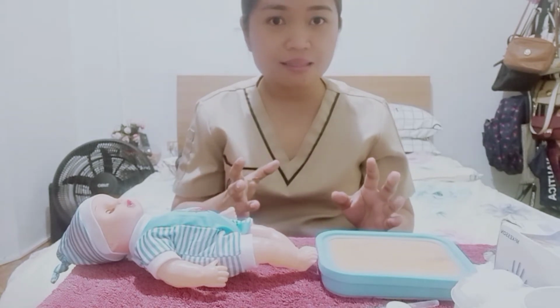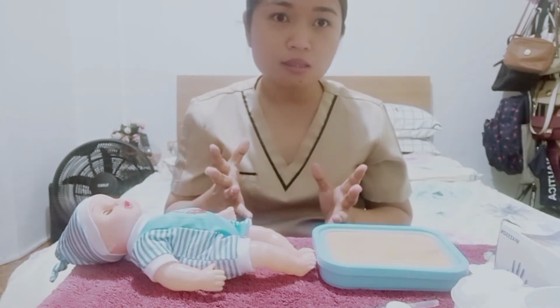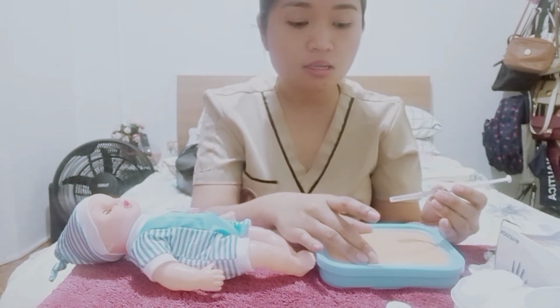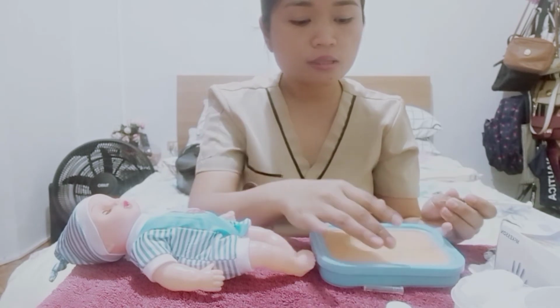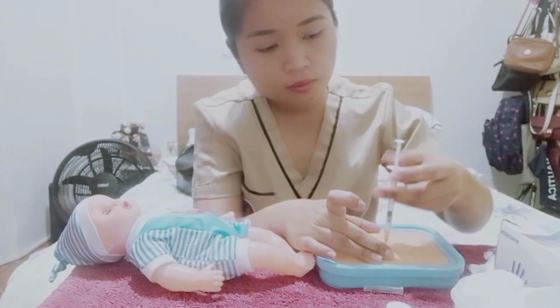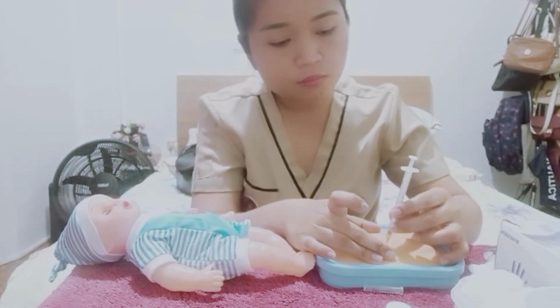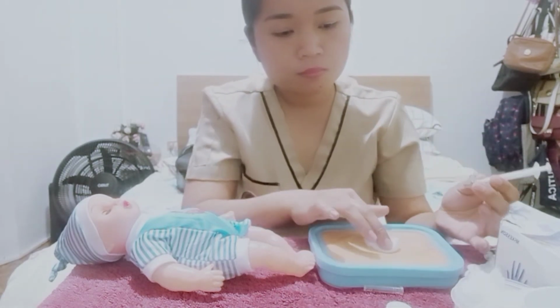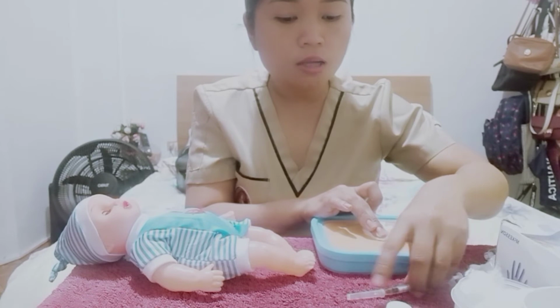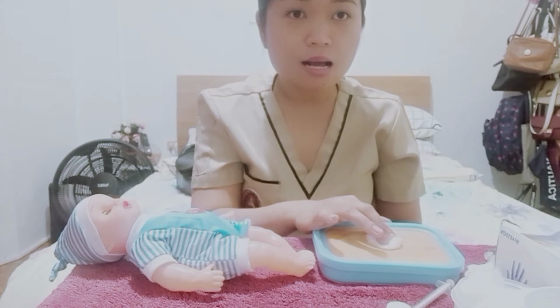So let's just pretend that this is the vastus lateralis of the patient, because this is made of plastic, so I really cannot inject it. So we are going to pierce the skin, okay? Inject it at a 90-degree angle. Okay, and then inject. Okay, and then remove the injection. And then we just have to press it with a dry cotton ball to stop the bleeding. So that's how we are going to do the IM injection.